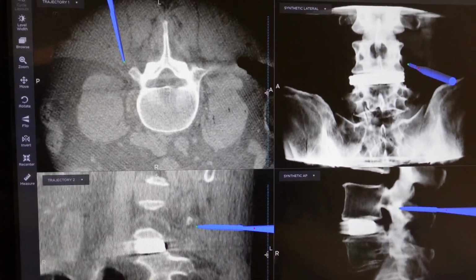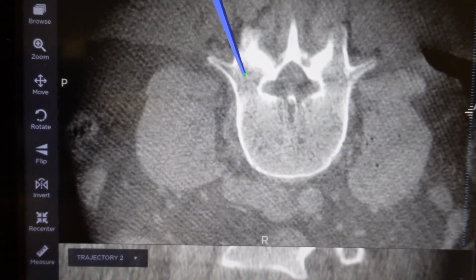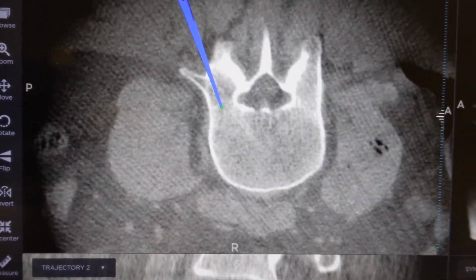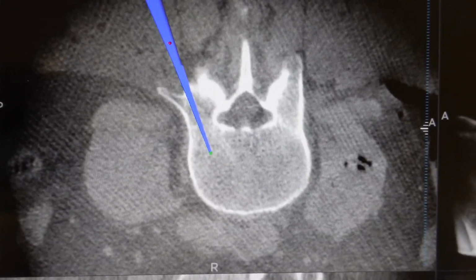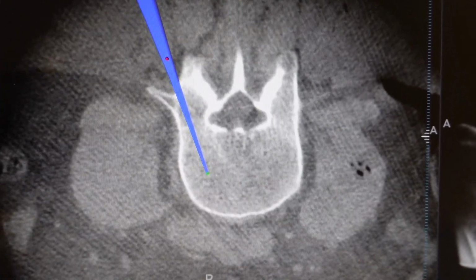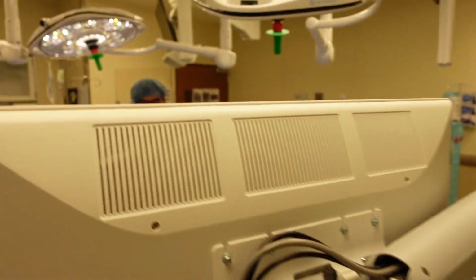Now this is an interesting level. Look at the entry point of this one. It is on the downward slope. It's really hard to get a Jamshidi needle to go in that direction, but once you make the perfect starting hole with a burr, now the thoracic probe just guides you in, using tons of tactile feel and just letting it fall in. Oh, that's going to be a perfect screw.